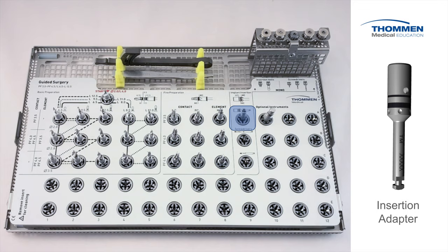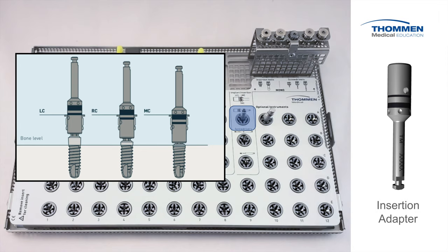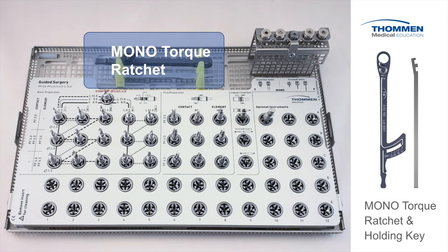This single instrument is designed to insert both element and contact implants with MC, RC, and LC collar heights. It is the one instrument in the guided kit that does not have a physical stop. This design element provides unique procedural control for the clinician and a universal application for all Toman implants. Along the top we have the mono torque ratchet and holding key, recognized for its precision and award-winning state-of-the-art design. The one-piece construction dramatically simplifies regular maintenance as there are no parts to disassemble for cleaning — one of the most accurate and dependable torque devices on the market.